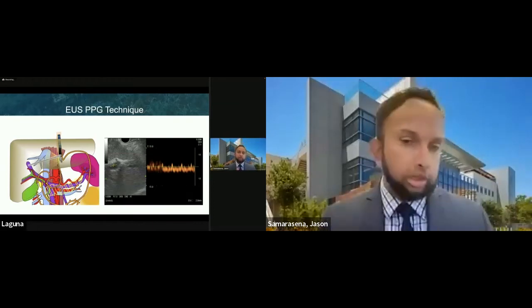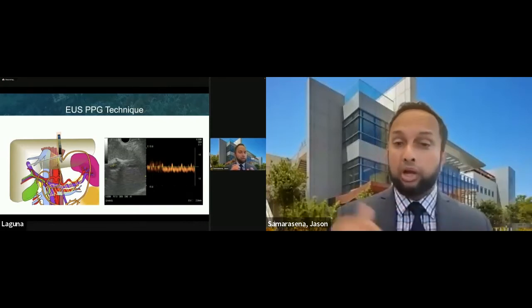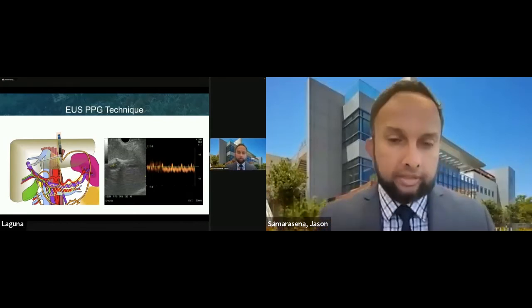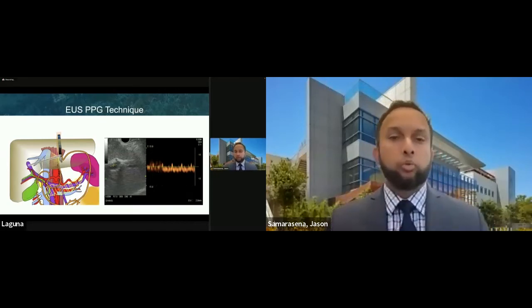In some of the original work done in this area, a transduodenal approach was used. Sometimes you were not going through parenchyma, and I think that may have been one of the reasons why there were complications in the early work in this area.